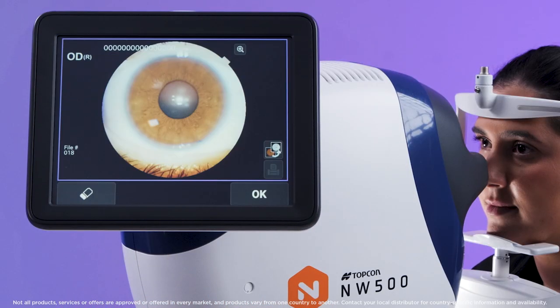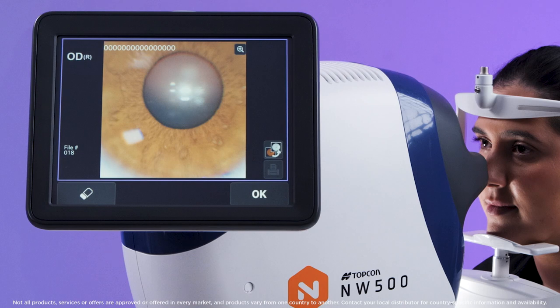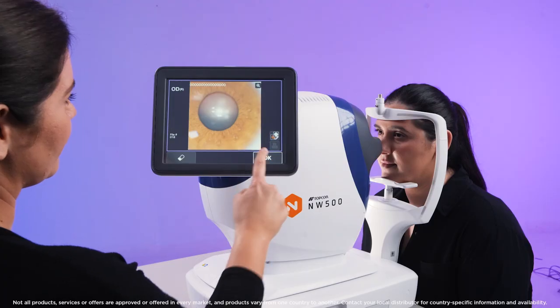The image preview will be displayed on the instrument screen. If the image capture has been successful, press OK to save.